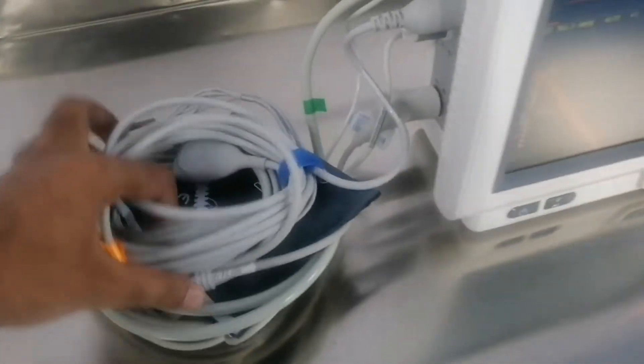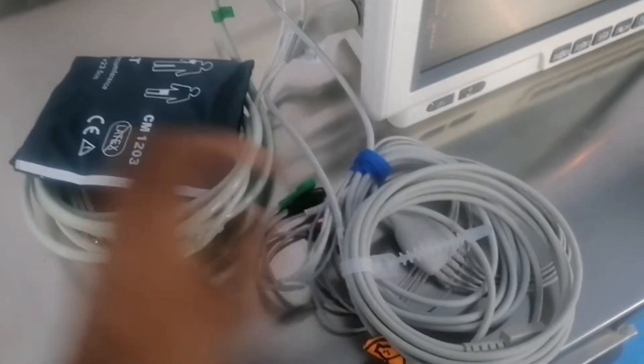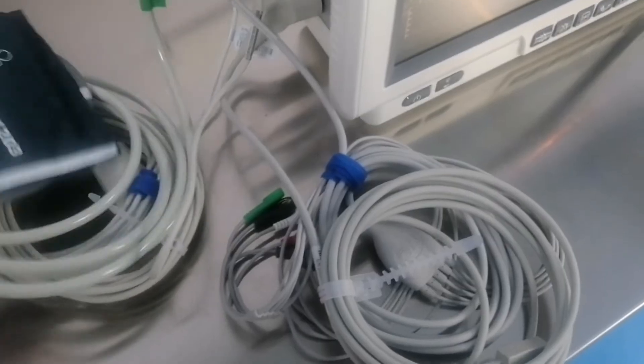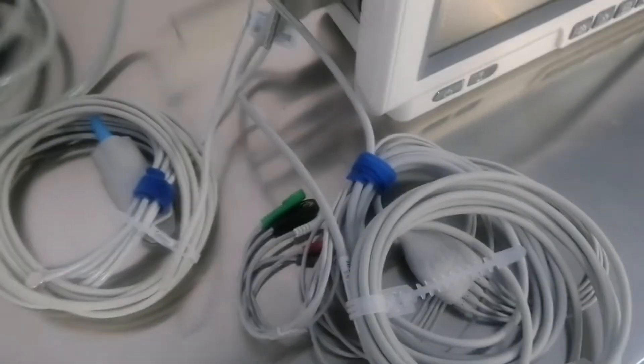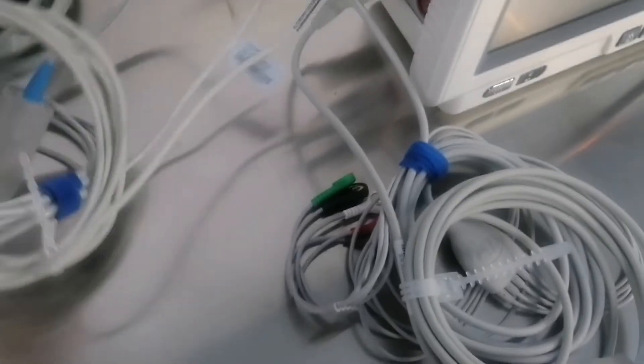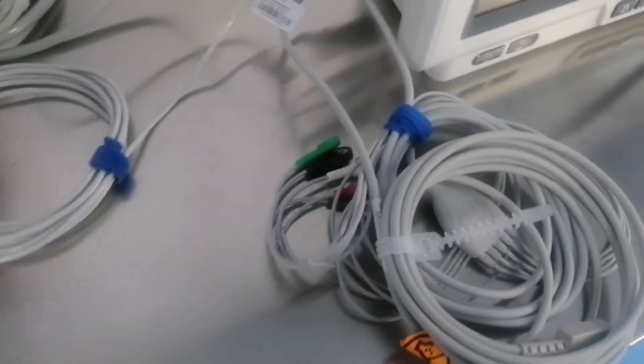So guys here are all the accessories of this monitor. Here is the ECG cable. Here is the IBP cable. Here is the NIBP and SPO2 and the temperature skin temperature probe.